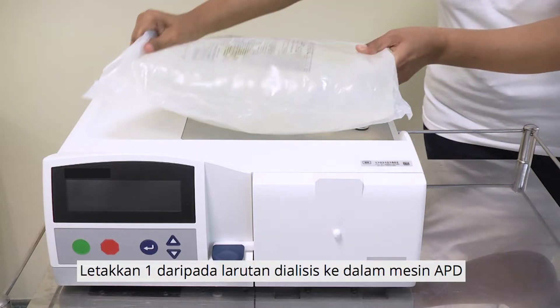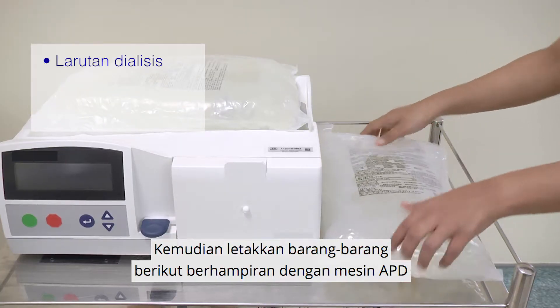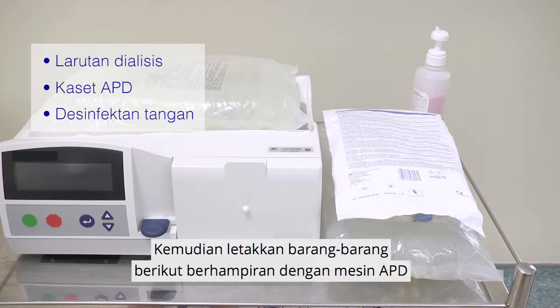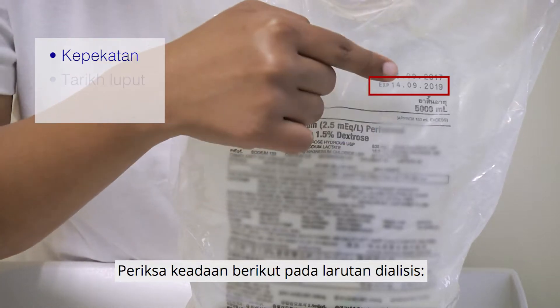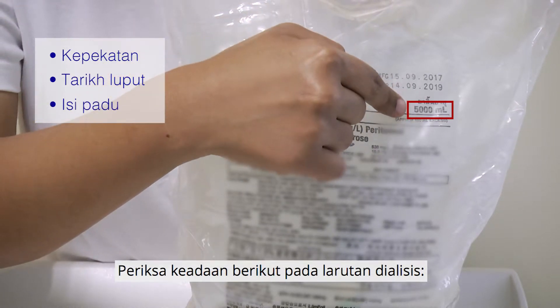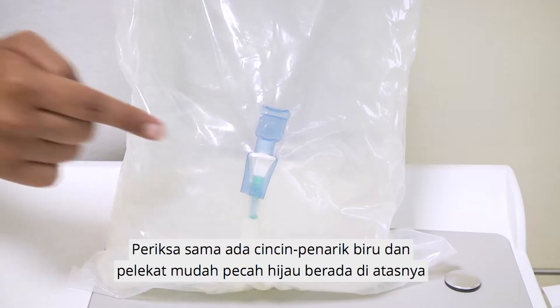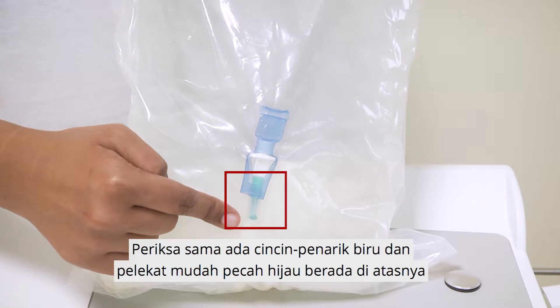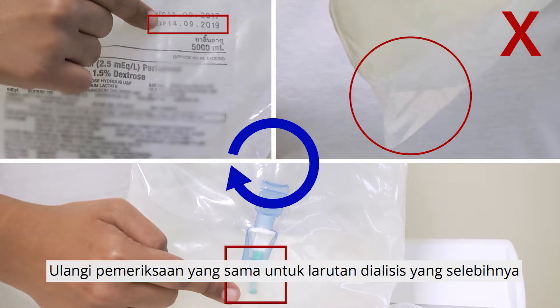Place one of the dialysis solutions on the APD machine, then place the rest of the dialysis solutions, APD cassette, and hand disinfectant next to the APD machine. Check the concentration, expiry date, and volume of the dialysis solution. Check for leaks in the dialysis solution. Check if the blue pull ring and green frangible seal are there. Repeat the same checks for the rest of the dialysis solutions.